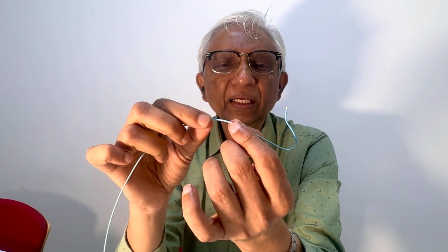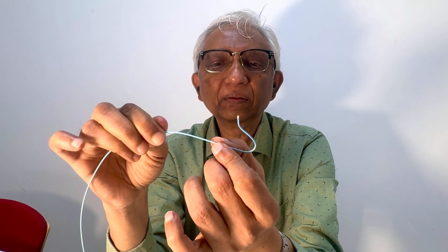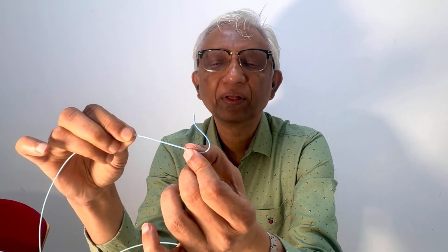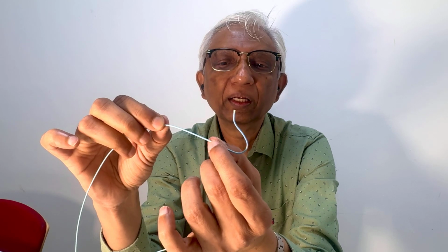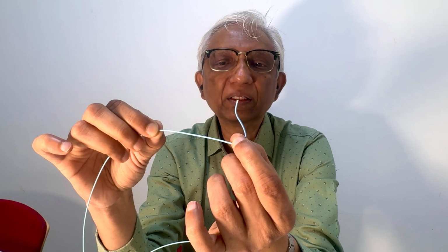Now, when you come out, remember that this is the arch, and as you pull it, it will enter first into the innominate artery. Push it down, rotate it out, pull it a little, and then pull it. It will enter into the left carotid artery. Then push it out, rotate it a bit, and you can enter into the subclavian artery. Have you got this? Okay, so understand that. So this is how we do it. We go in, we hook the ostium and we pull it. And as we pull it, it will straighten up and enter this vessel. Then after that, you can cannulate the vessel.